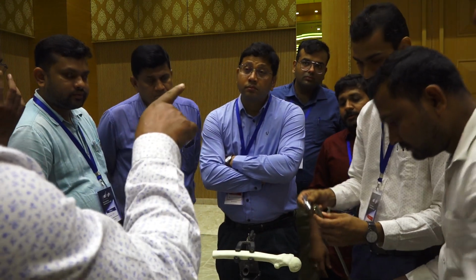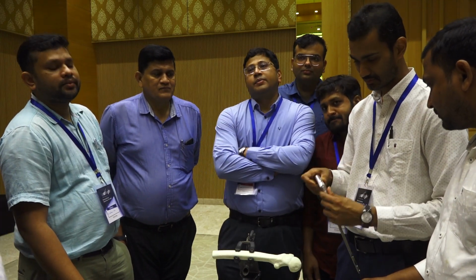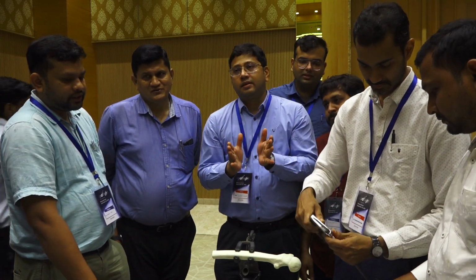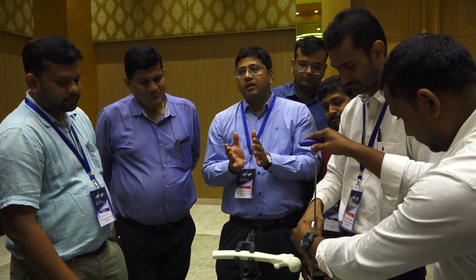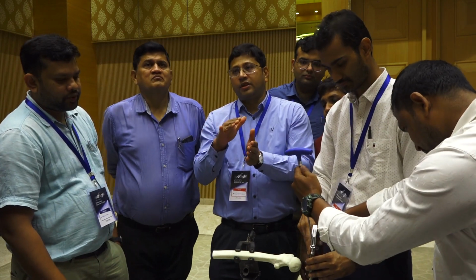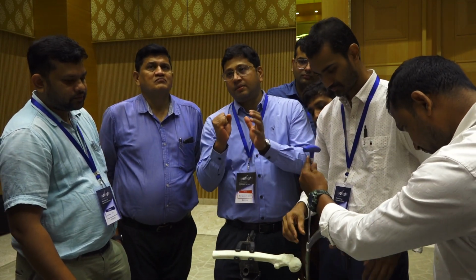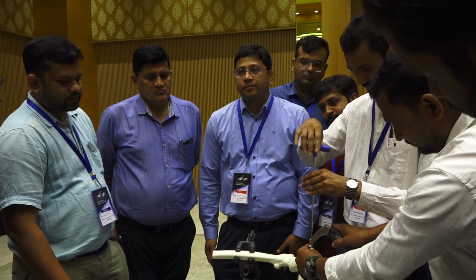Well, as the manual says, better to go for center. Go for center always. If you have to err, you try to err on more inferior and more posterior, because that is the densest part of the bone, and you get a good purchase there.